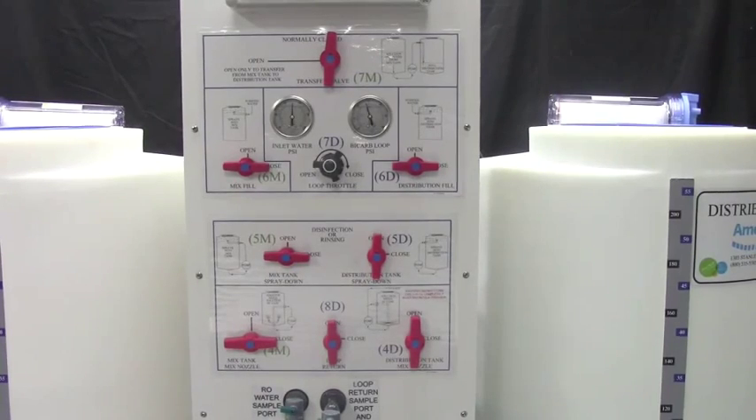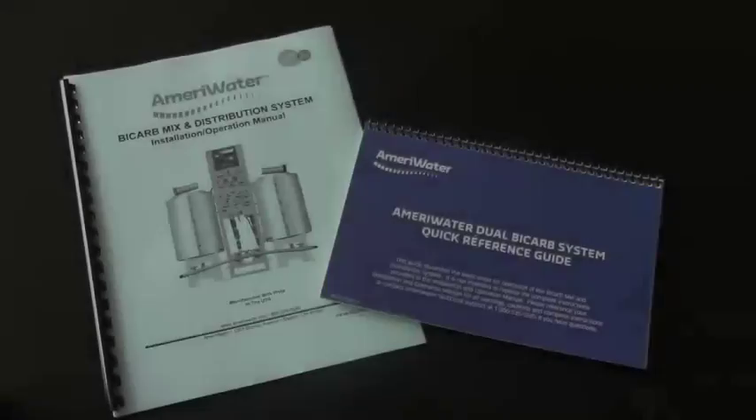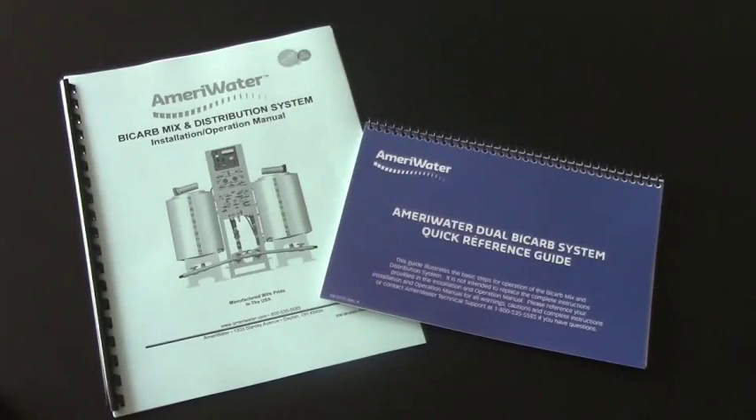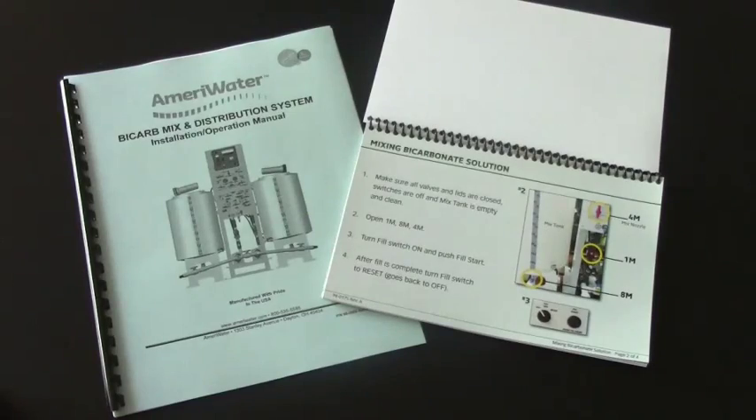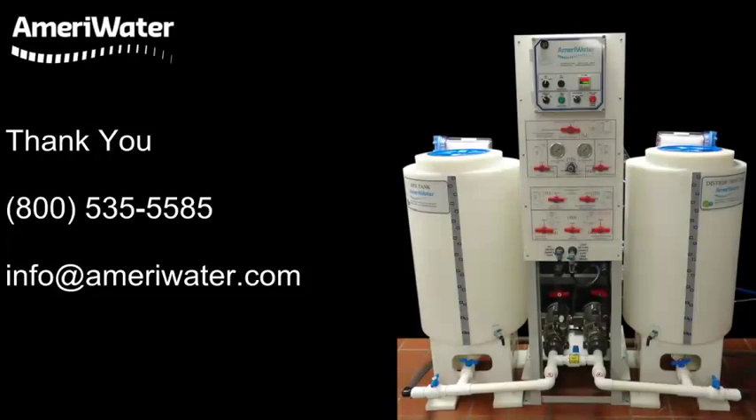This concludes the operation training video for the dual tank mix and distribution system. For more information on your bicarb system, please refer to the operation manual and our easy-to-use quick reference guide. Thank you for choosing AmeriWater.